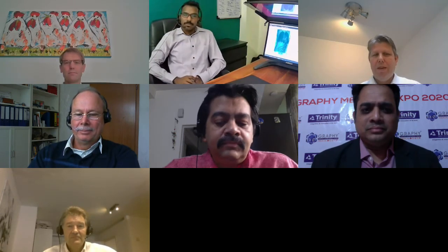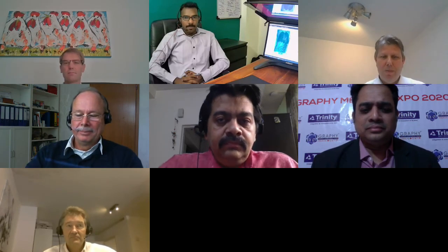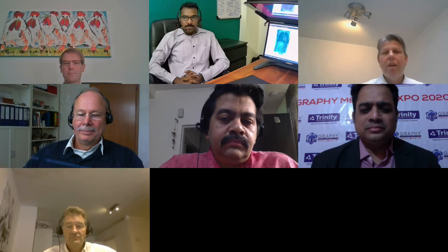Some of them just want to see the vascular structure. Others have way different requirements. But Visualisation was developed from a broad perspective: we want to create a visualization tool that allows you to get to the right visualization and the right point of view extremely fast, and from there on, specializations were developed. Yep. I hope I answered your question.